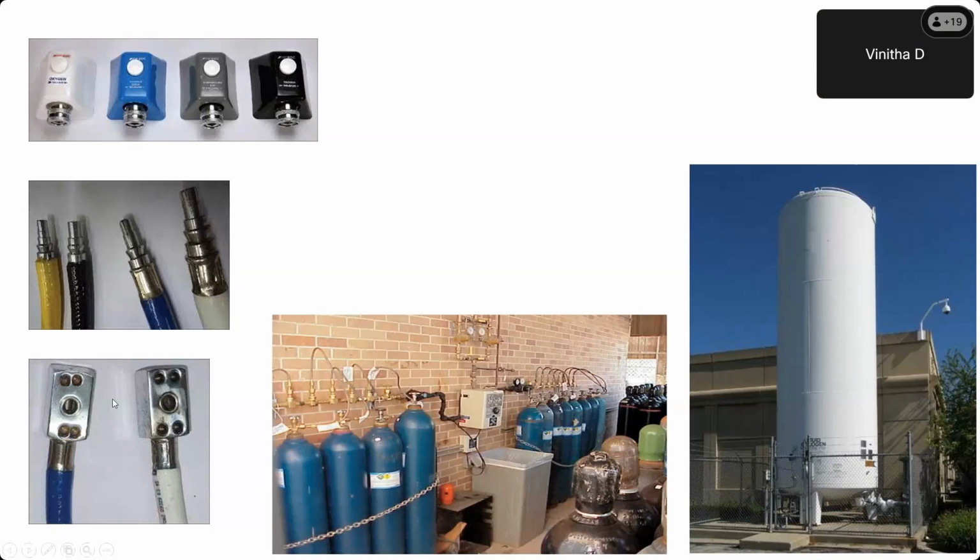You find there is one big opening. Nipple of the cylinder. This is called the valve block. Okay, valve block which is attached to. Sorry, not the valve block. It is the pin index block which is attached to the hanger yoke assembly.